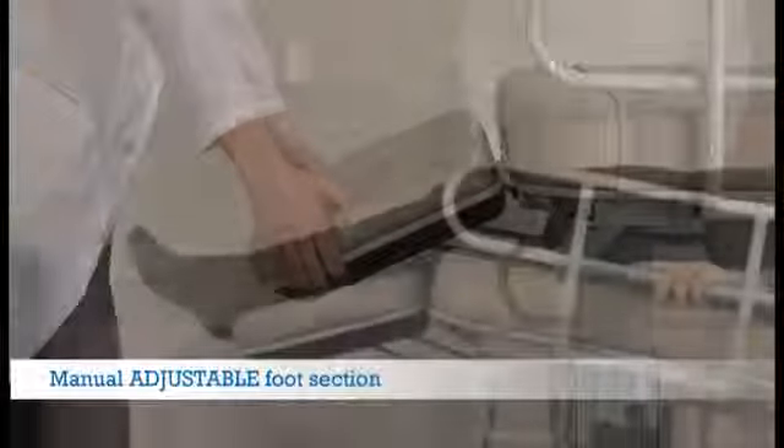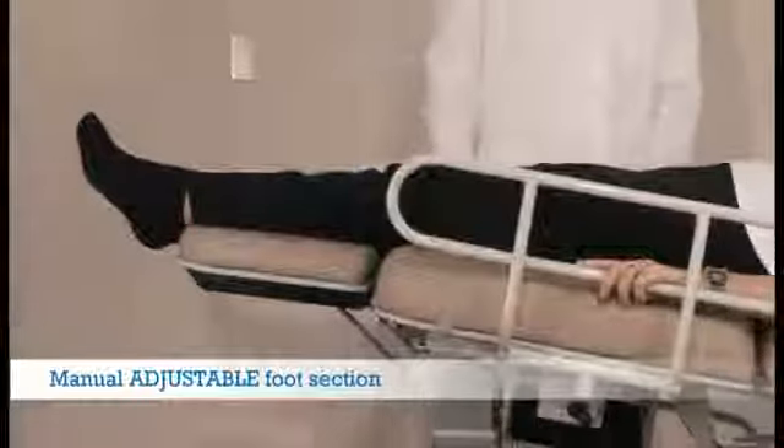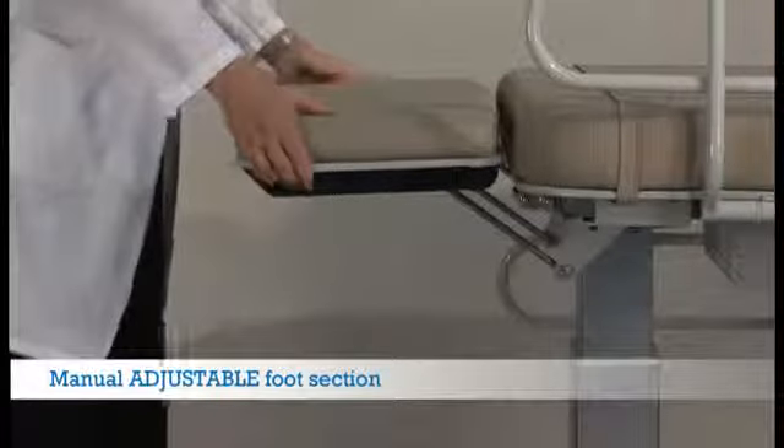The foot section can be left in the down position even when the table is at 22 inches high. The flexibility and one-handed operation ensure that a comfortable angle can be found for every patient.